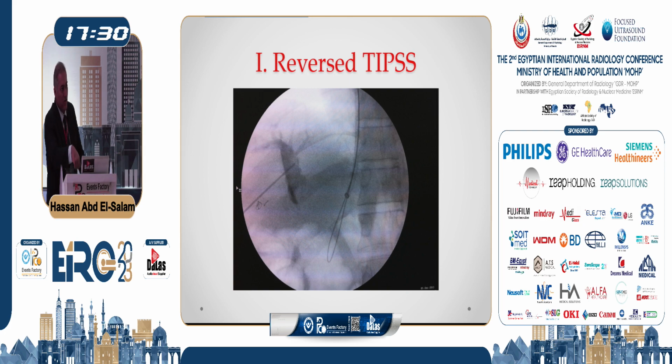So this is the reverse TIPS. First of all, we percutaneously puncture the portal vein, and then in a straight line, the Chiba needle is introduced into the hepatic vein or the IVC. Then a wire is passed and snared by a snare introduced through the internal jugular vein, and then the procedure is standard TIPS after that.